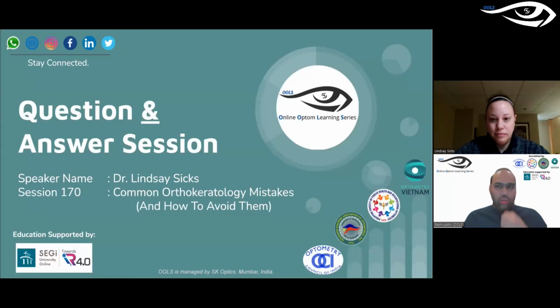Thank you very much. There was one thing which I was curious about in terms of the fitting assessment. So you did mention that you have to look at everything together. Don't just base it on fitting assessment. Look at the topography, look at the outcome as well. My doubt was, or probably you want to share your expertise on the fluorescein assessment when it comes to instilling the fluorescein. Do you prefer to instill it after the lens, or do you dip the fluorescein in the bowl and then put the lens on? What does your experience or expertise say?